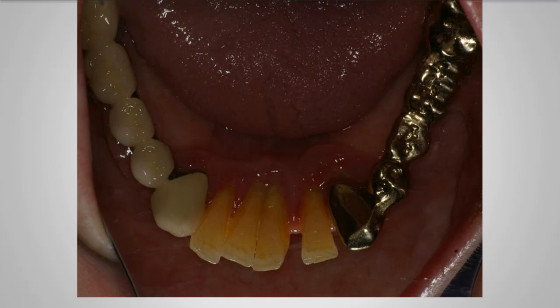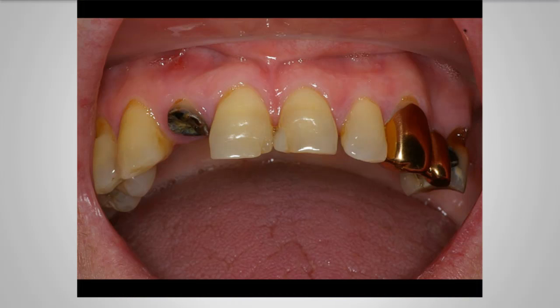One concern we had was when we were taking impressions for the immediate denture that some of these teeth may come out in the impression. Fortunately, this did not happen.